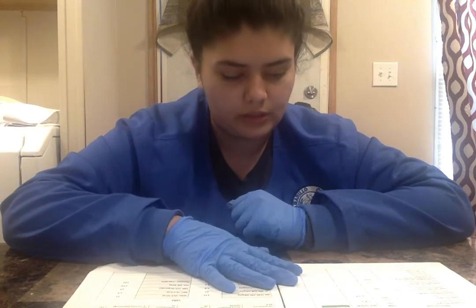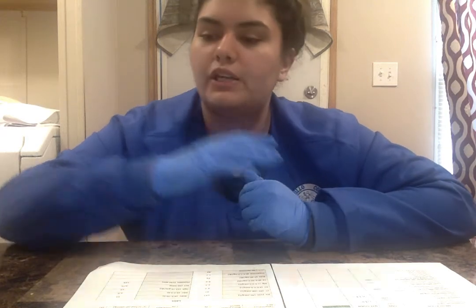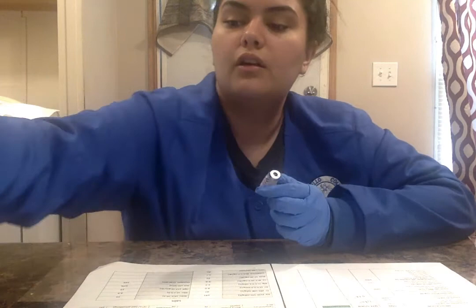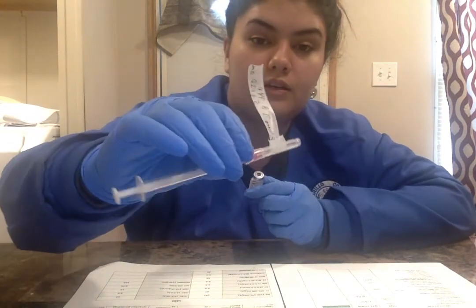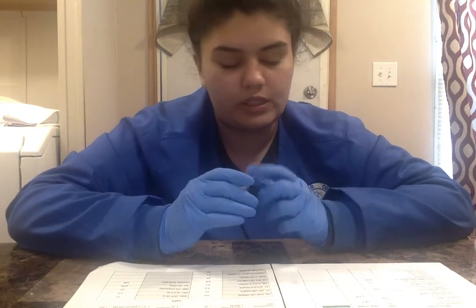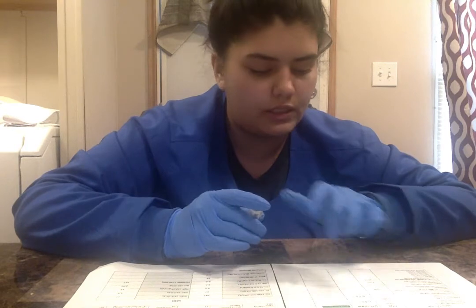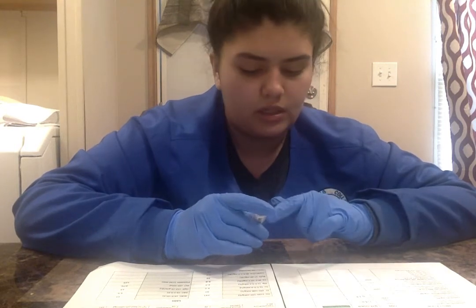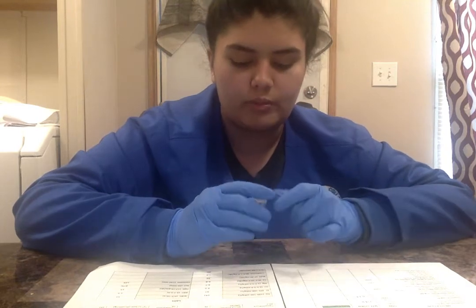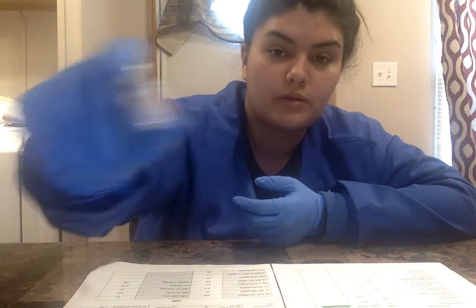But moving on to tuberculin. Tuberculin is an intradermal medication. So we're going to go ahead and get our vial out of the cart. We're going to get our PPD. We're going to get our syringe out of the cart. We're going to compare it. We're going to do our third med check. We're going to go ahead and do tuberculin PPD 5TU, PPD skin test, 5TU, that matches. We're supposed to give this 0.1 milliliters intradermal today. This is an intradermal medication. Everything matches. This expires 6/23 of 2020. I'll make sure that this is the right medication, and it is.